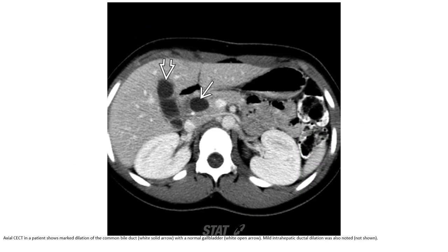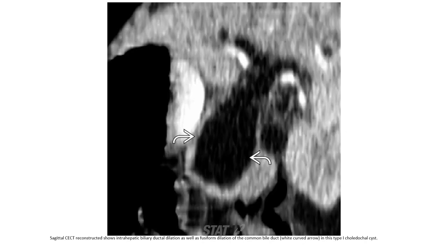Contrast-enhanced MRI in a patient with choledochal cyst shows a normal gallbladder; mild intra-hepatic duct dilation was also noted. MRI reconstructions demonstrate intra-hepatic biliary duct dilation as well as fusiform dilation of the common bile duct in this Type 1 choledochal cyst.